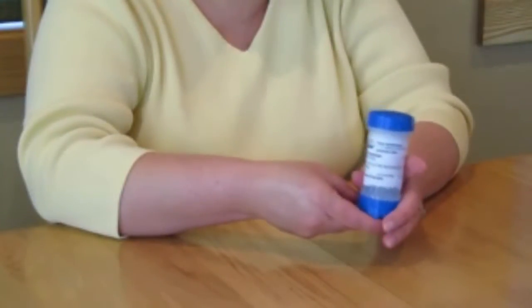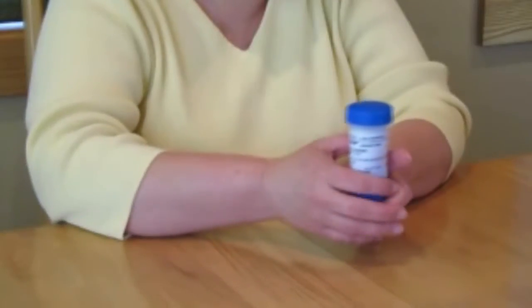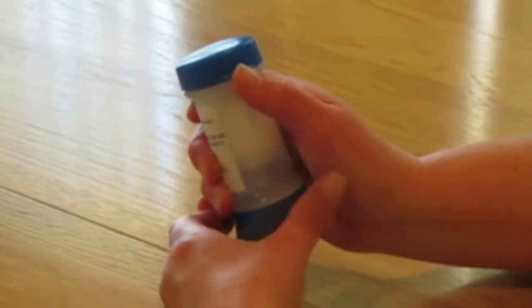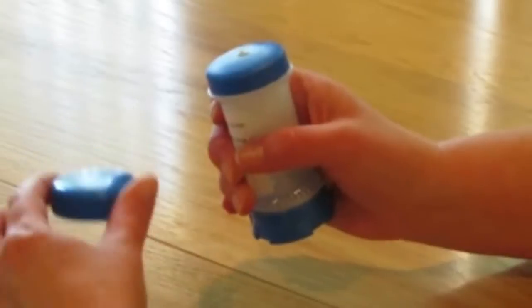Begin by popping off the cap of the ToppyClick container by placing your thumb under the tab on the protective outer cap and pressing upward.